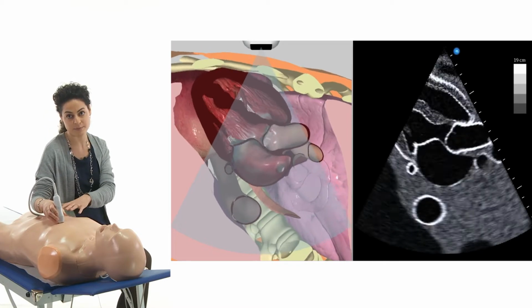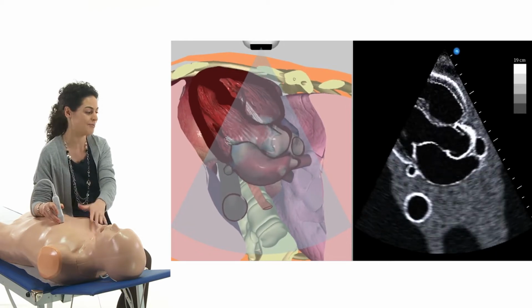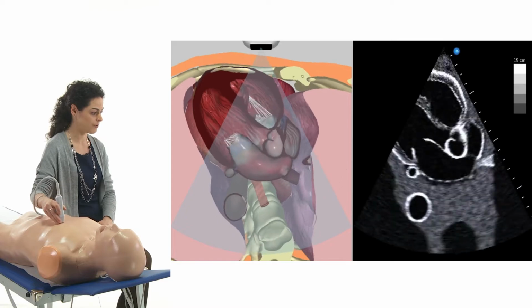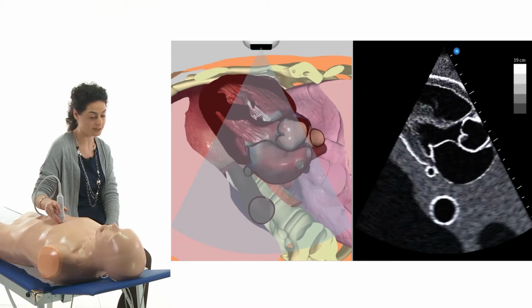In real patients, it's not so easy. Actually, you need another view to see the arch, but this is advanced, and we will show you in the master class. For now, I'll show you other views where you can appreciate the descending aorta.